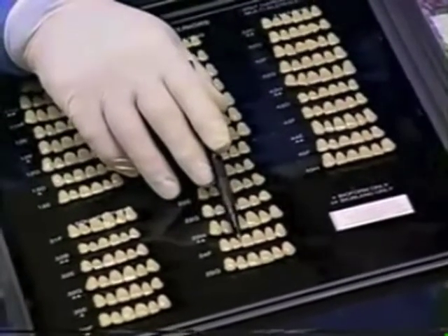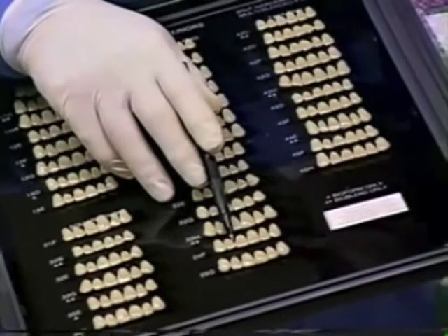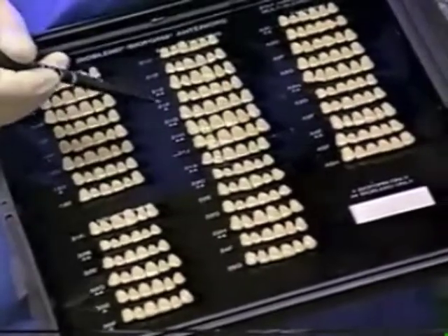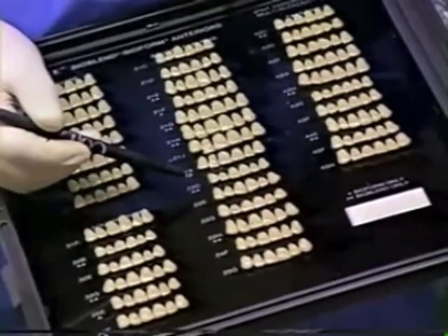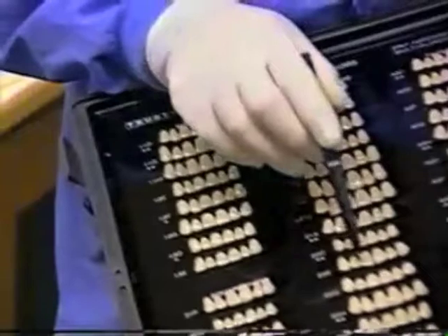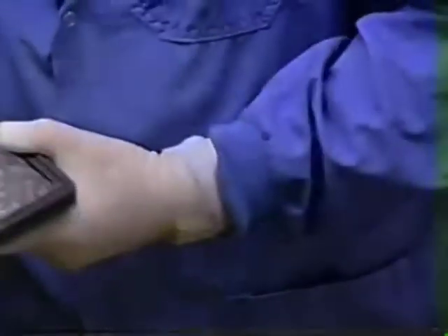And 24F we thought would work — which is this tooth. It's 12 millimeters long, which is too long, so we eliminate that one. 22E is a good possibility. Now let's see what we can do with that.